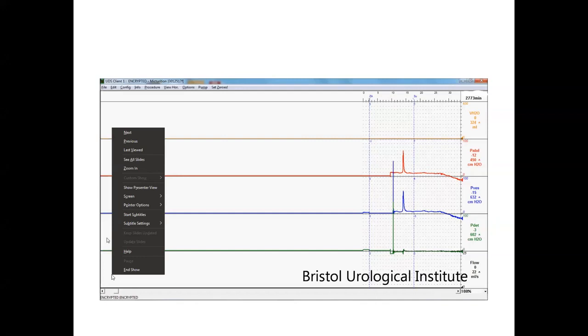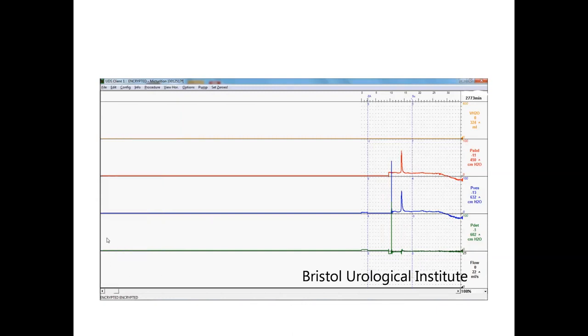So if your catheters come out, it would be both catheters at exactly the same time. So it's a fair shout that if your catheter has fallen out, it's below the level of zero. Absolutely. The giveaway here is that you're right, it's both catheters. So it's something usually in relation to where the transducers are. So your patient moving would be the most obvious one. In this case, we have a mechanical movement of the transducers, either up or down. So this steady change might be us moving the transducers around our patient, or the patient very steadily moving into a different position. So what do we need to do about that?